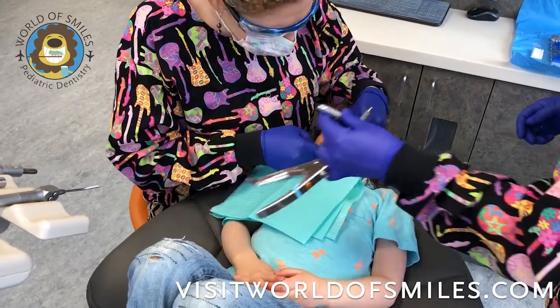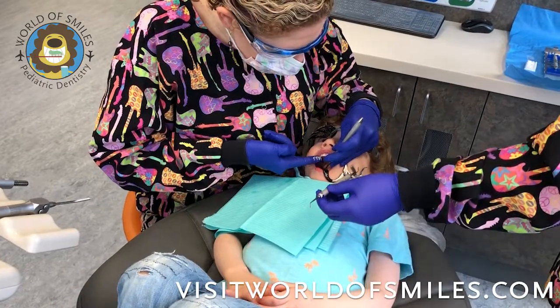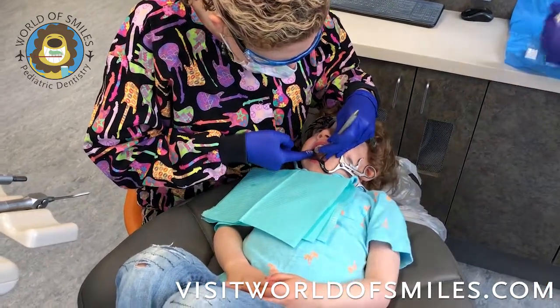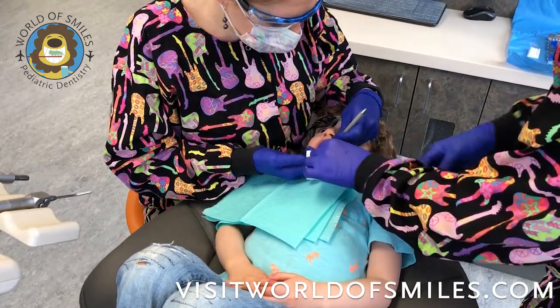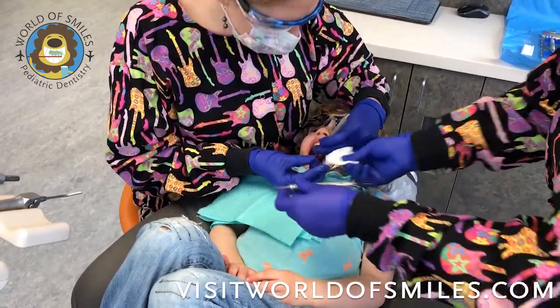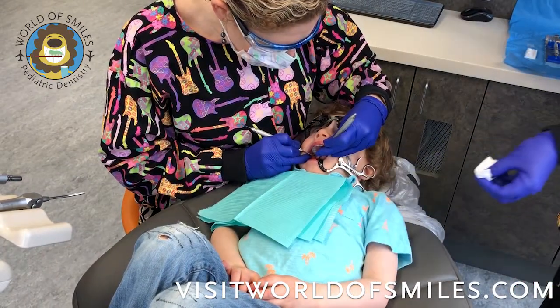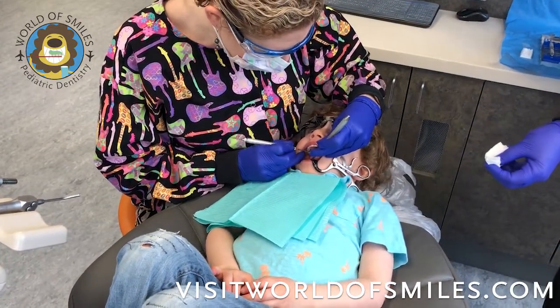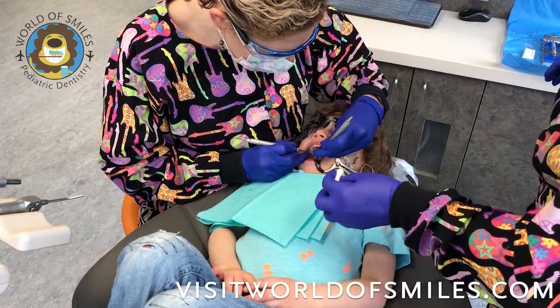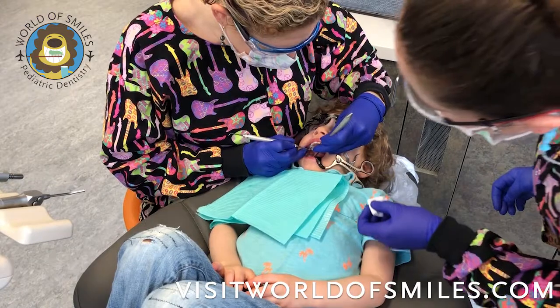You apply it with the applicator, and then I actually use my finger to get it into all the grooves and crevices of the teeth, and then I will use my instrument to fine-tune it and make sure that the tooth is covered appropriately, building up the function of the tooth back to its original functionality as best as you can with the glass ionomer.